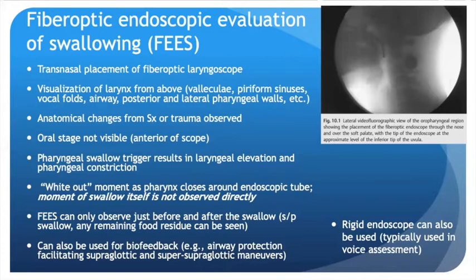You can see this with a modified barium swallow study, but you can't see the moment of swallowing with a FEES. You can only observe just before and just after the swallowing. That being said, you can observe if there's any remaining food residue or pooling in the vallecula or piriform sinuses or even in the vestibule. You know, that would be penetration, of course. You can also use FEES for biofeedback, to examine how effective a patient is at protecting their airway, maybe performing a variety of postures and maneuvers of swallowing with various consistencies and see what is the most effective strategy for that particular patient.